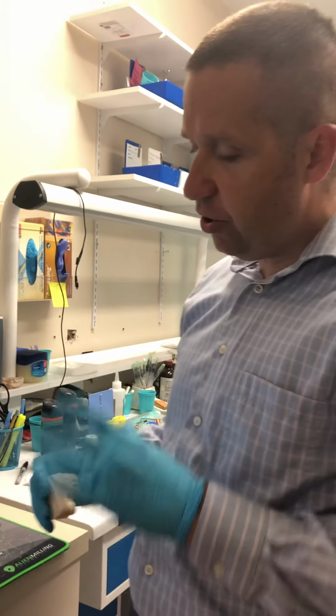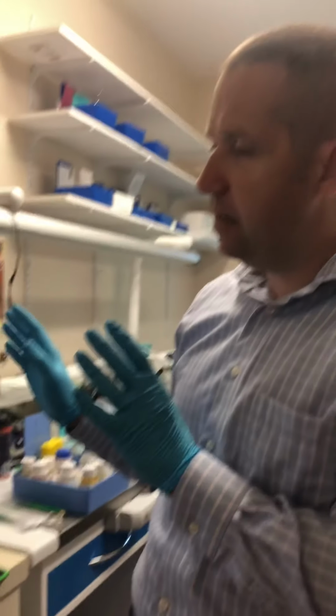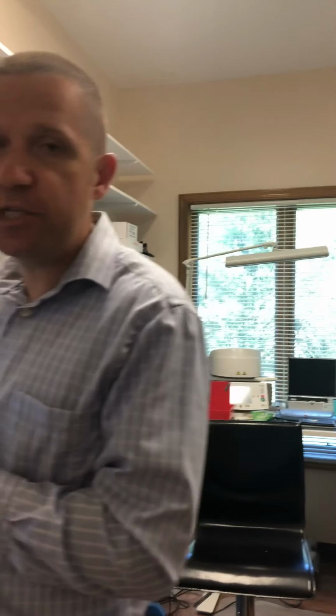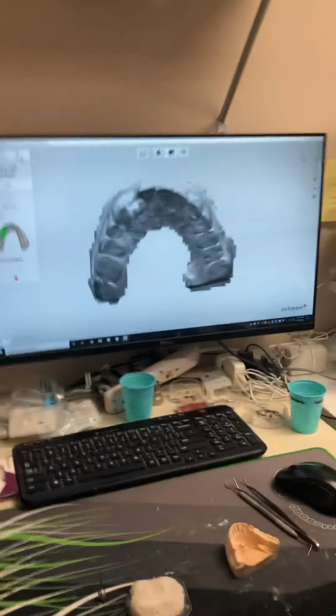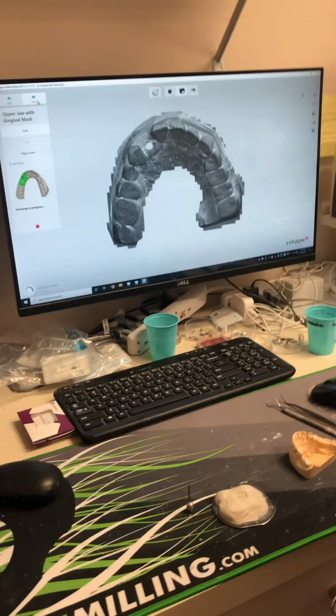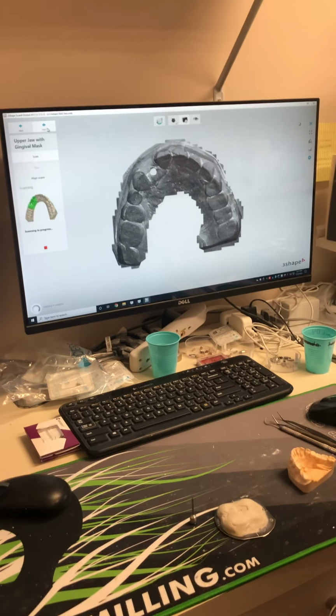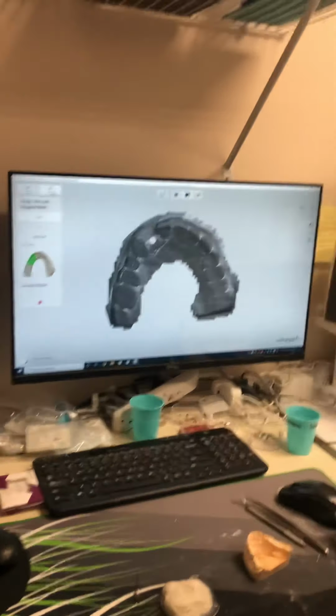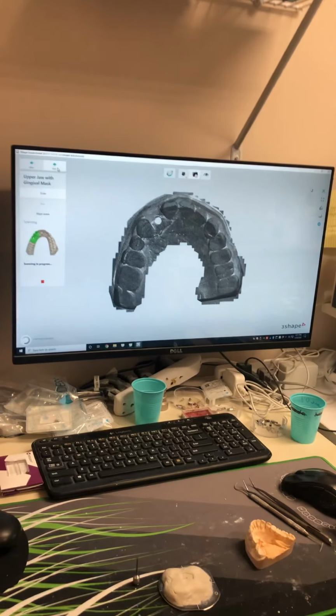Also, you're gonna realize some of the angles in there, like when you prepare the teeth or you prepare for the implants or you insert the implants, you have a totally different perspective when you have to manufacture your own work. But it's very easy. So you scan it, or this is done by the assistant, and after that you're gonna see the design goes really, really quickly. A crown like this probably is gonna take me 3 minutes, if that.